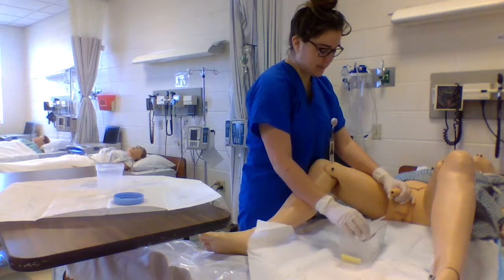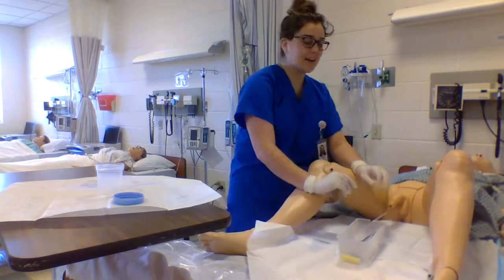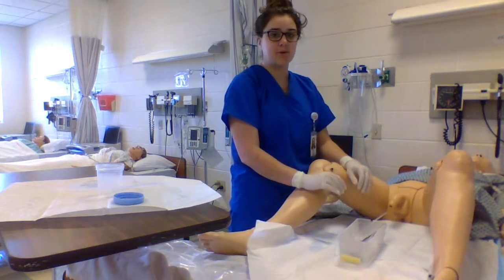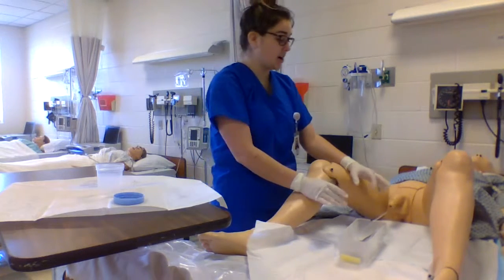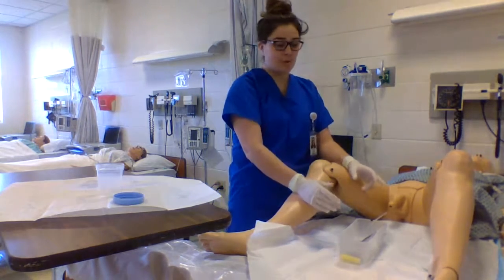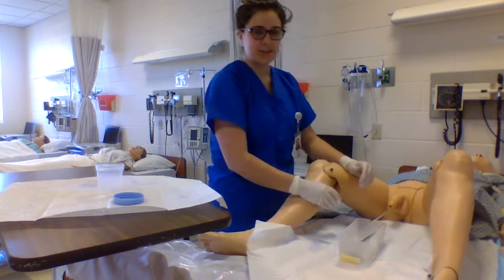Sometimes this can be a little bit messy. And I'm going to replace the foreskin. And I'm going to clean everything up and make sure Mr. Jones is comfortable. Make sure that I continue to check on him, make sure that he's not having any issues with controlling his bladder or anything like that after this culture. So thank you.